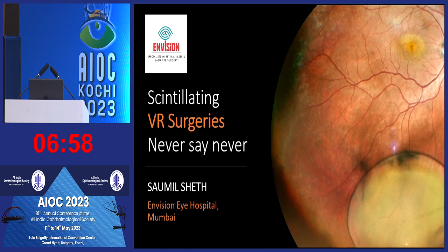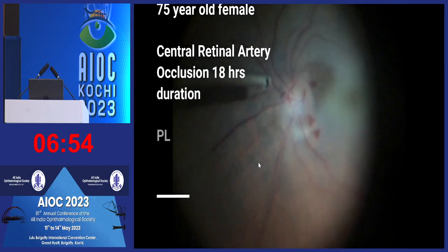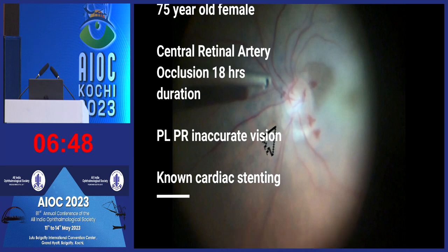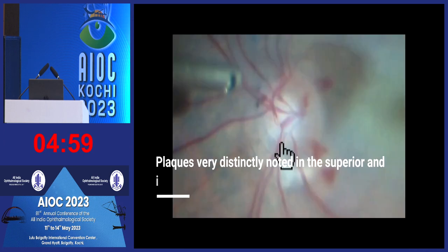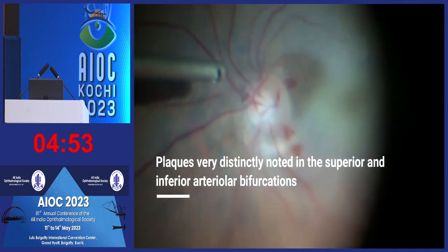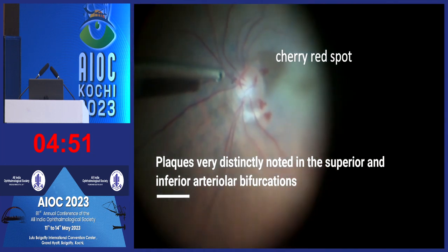Okay, I'll just play this video and I'll be talking as it plays. Scintillating VR surgeries, the take-home message being never say never. It's a 75-year-old female with a central retinal artery occlusion, as you see here, with a cherry red spot and whitening of the retina. You see the embolus at the superior and the inferior arteries as they come out of the optic disc. You see the pulsations, and the cherry red spot is very evident.